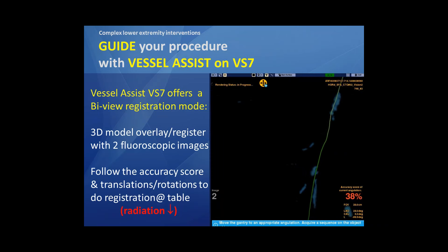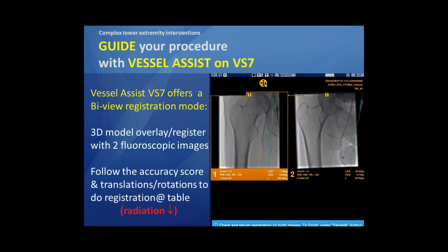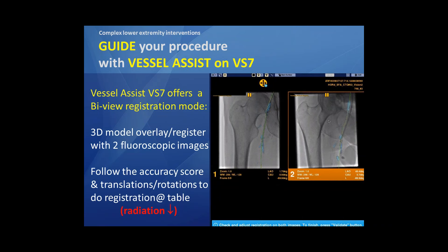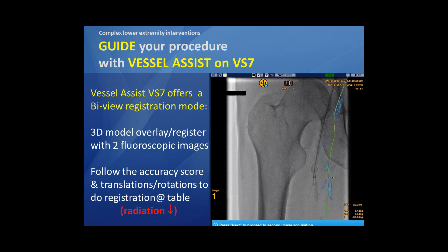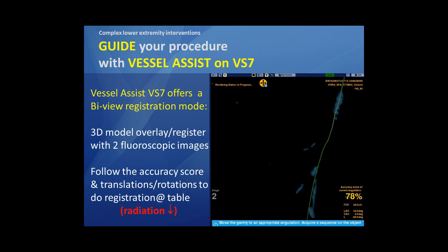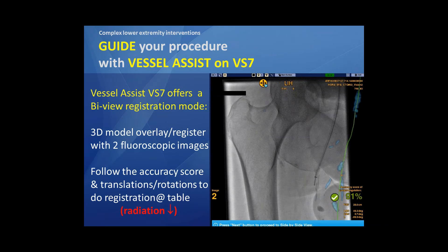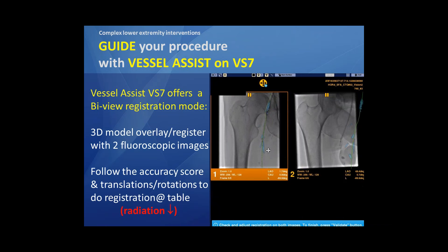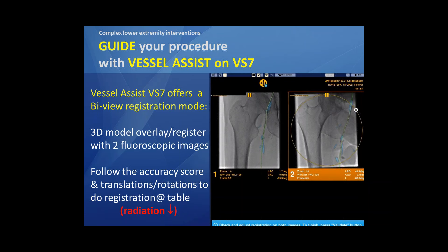Now we switch to the day of the procedure. How do we fuse our prepared 3D model overlay and registration — how to fuse it into our live images? This is, in my opinion, one of the biggest advantages of the Vessel Assist VS7. It offers the bi-view registration mode, meaning we can fuse our 3D prepared model just with the support of two fluoroscopic images, as you can notice here in our example.